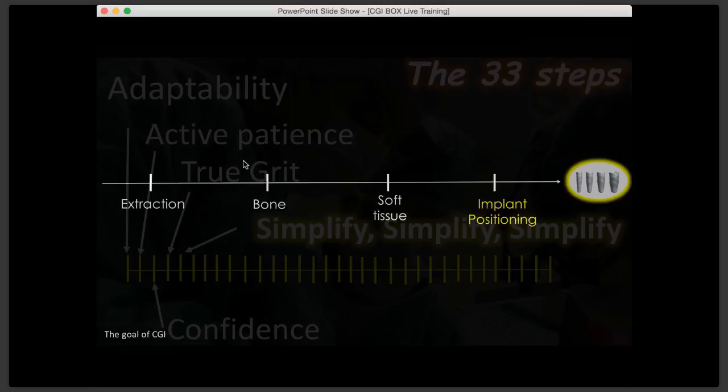The more DICOM images you have, it's going to slow down your computer power. It's going to take more memory. I found that it doesn't make any difference if you have more slices or not. Of course, if you have too few slices, you don't have enough information, and you may miss an important point of information in one of those slices.